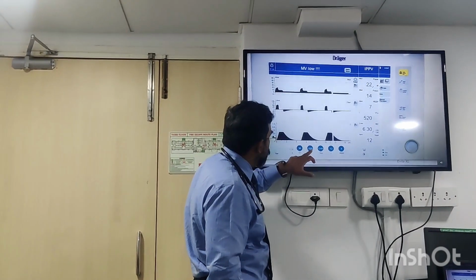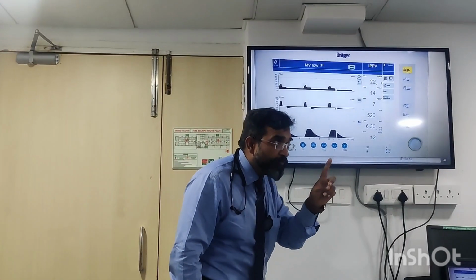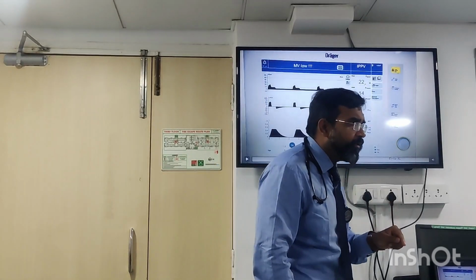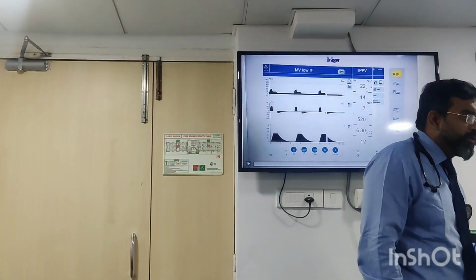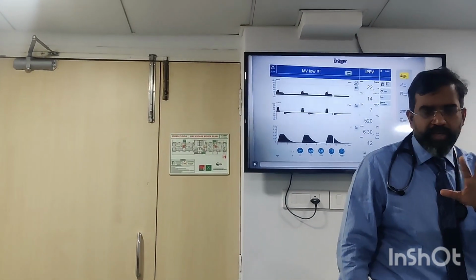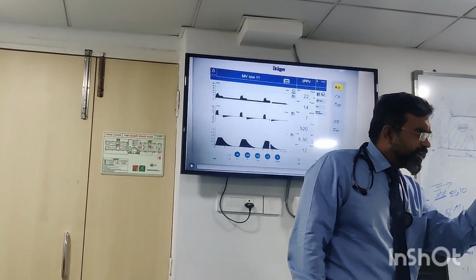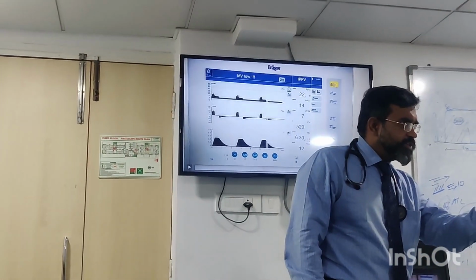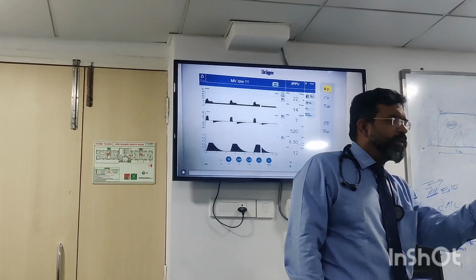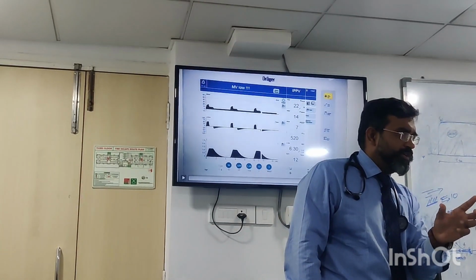What am I doing? I'm giving an I ratio of 1:2.5. That's why my flow is cutting off at 1:2.5. So for example, if frequency is 12, what is my breath cycle? 5 seconds. How? 60 divided by 12, 5 seconds. In that I put 1:2.5. In that 5 seconds, 1 part is inspiration, 2.5 is expiration. That is my ratio. So my inspiration will be say 1.5 or something, and the next would be expiration. Clear on this much?